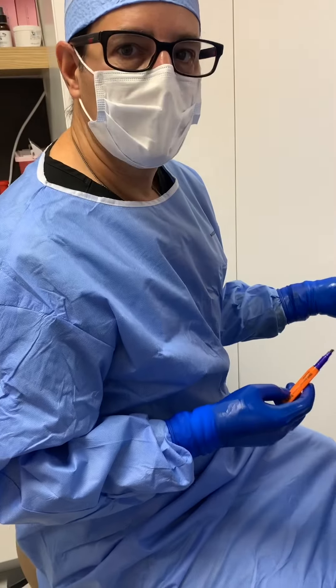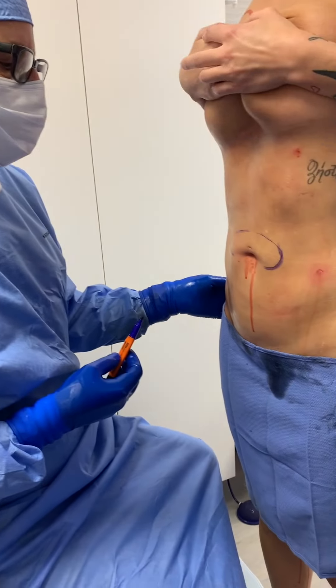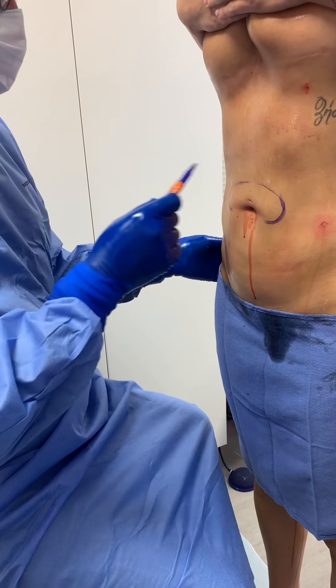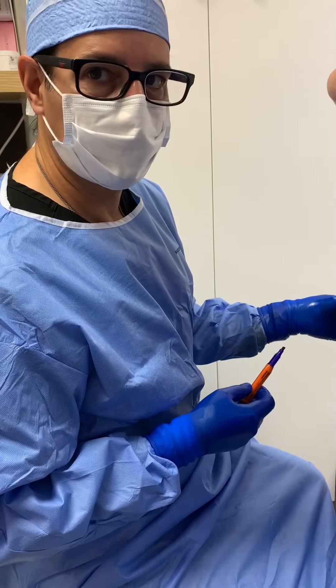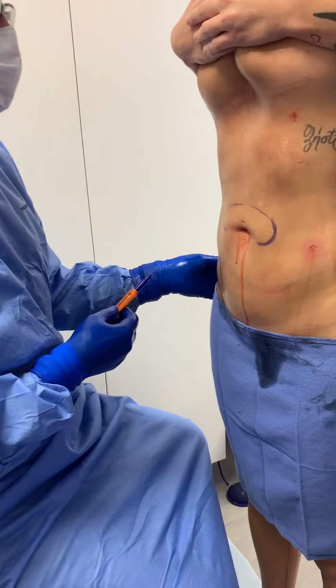This is what doing awake liposuction is all about — we have the advantage of doing this whereas if she was under general anesthesia we'd never be able to do this. Everything changes with gravity. When you lay her down her stomach is perfect, you stand her up you get a little pooch up here, so we're going to take care of that real quick.